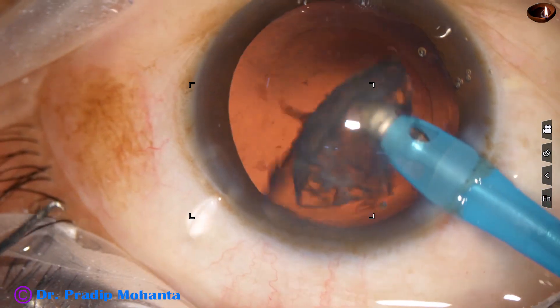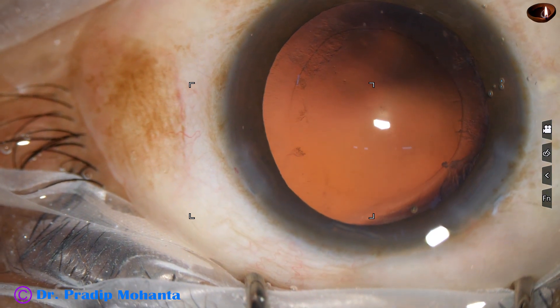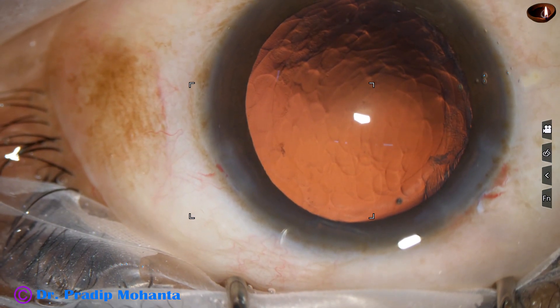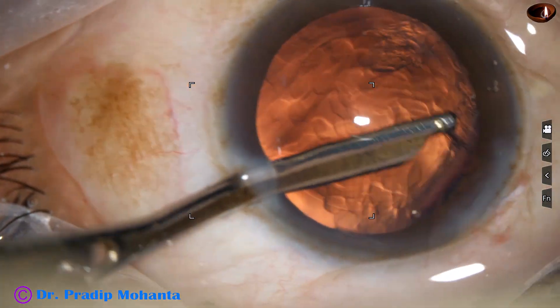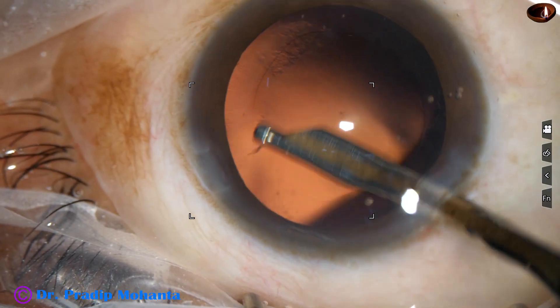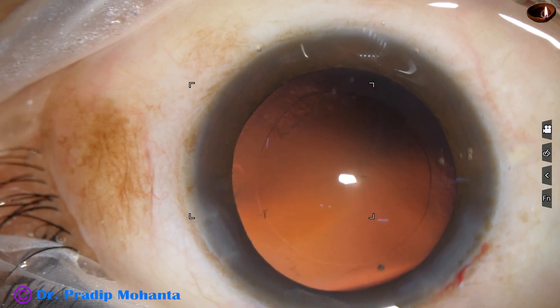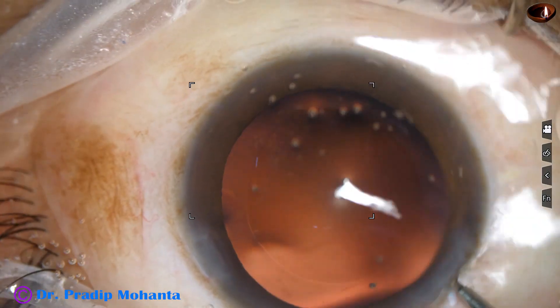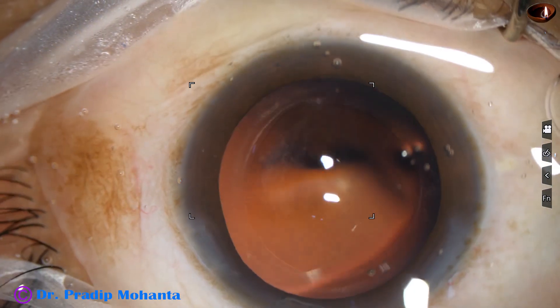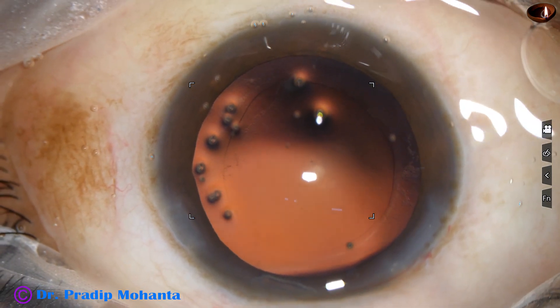Beginners can come out, inject some Visco behind the epinucleus — that is, between the posterior capsule and the epinucleus — and then take the epinucleus out. There is some cortex at around 10 o'clock; I go through the side port and remove this cortex. There is some cortex sticking to the posterior capsule at 5 o'clock in the periphery. I take the irrigating cannula of bimanual IA; the irrigating jet of BSS is directed towards this sail and the sail gets dislodged. So nucleus, epinucleus and cortical management has been done.